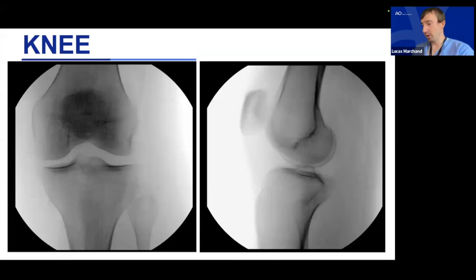So when getting knee radiographs, we're typically getting AP and lateral views. And I want to point out a good AP is where you have anywhere from about 33 to 50% overlap between the proximal tib-fib joint. That's how you know the rotation of the limb when obtaining the image is correct. On a lateral, you'd love to see perfect overlap of the distal femoral condyles, which you don't see here. But I'm going to show you some images where you get a nice contrast.